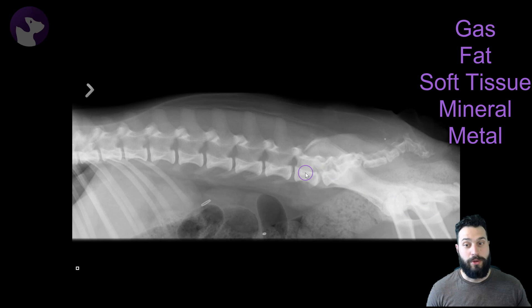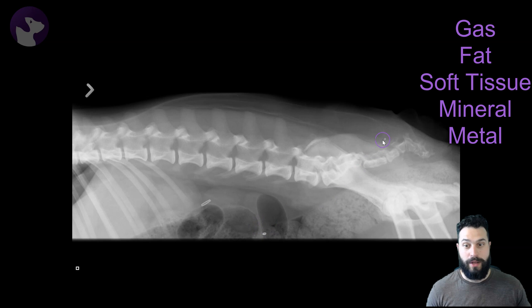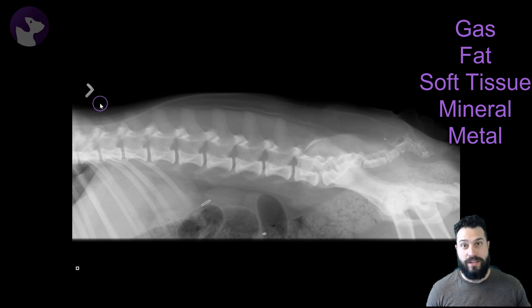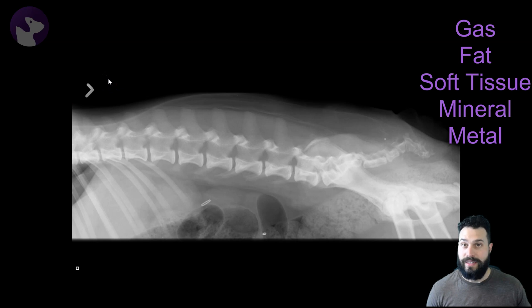And we have metal present. We have a couple of hemoclips in the abdomen, a little metal opacity here, and our left lateral marker. So these are the different opacities that we can identify radiographically, and I hope this has been helpful for getting started with radiology.